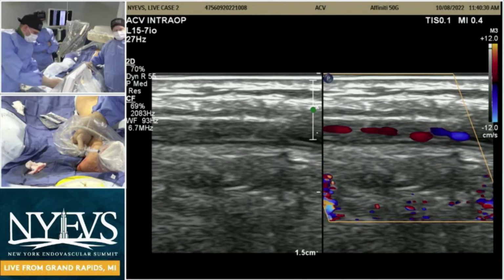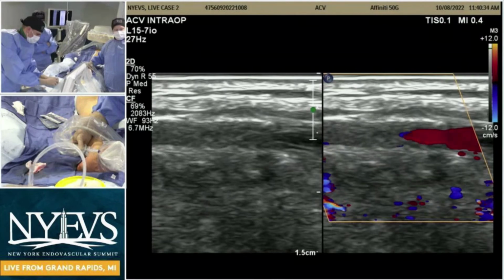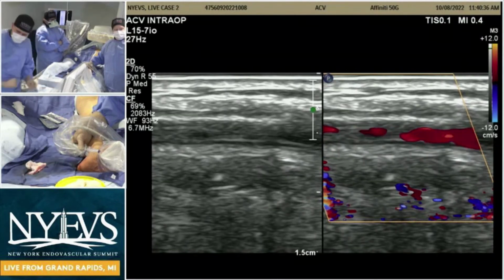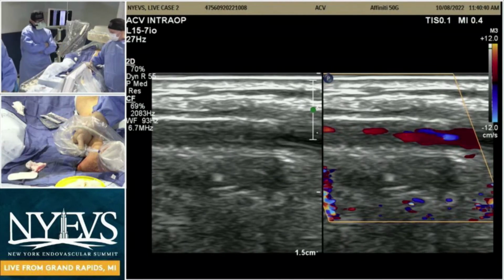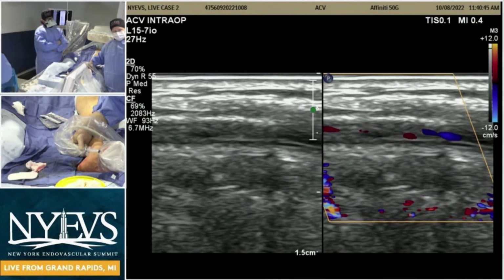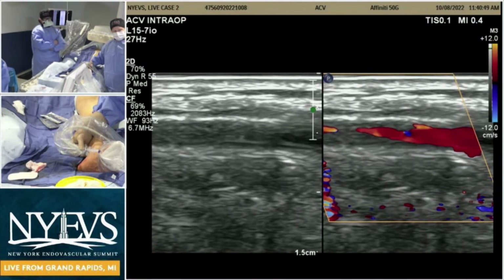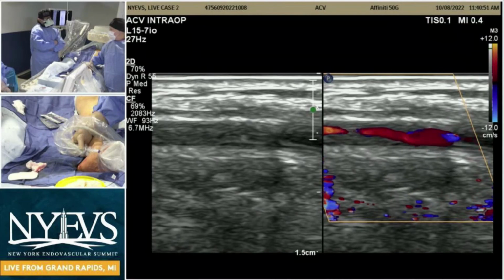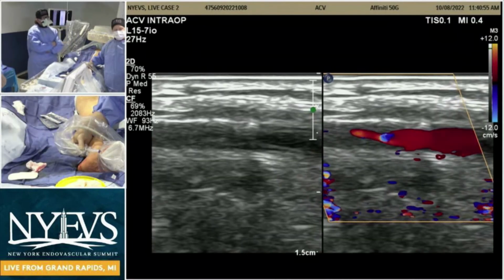And we're not trying to modify the plaque. Even though we claim we modify the plaque, we essentially do a controlled disruption of the plaque, and we put a scaffold and so on. So if you're not really modifying the architecture and not altering the natural course of the disease with these interventions, what exactly am I looking for in the IVUS once I finish the procedure, to see that, hey, I did the IVUS, and this is the end result, which should correlate with my wound healing? I'm going to leave that to Brian.